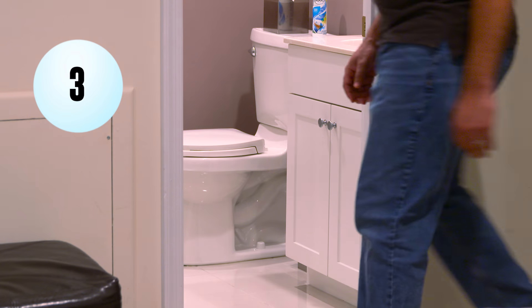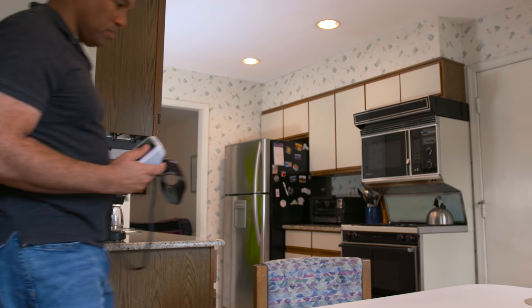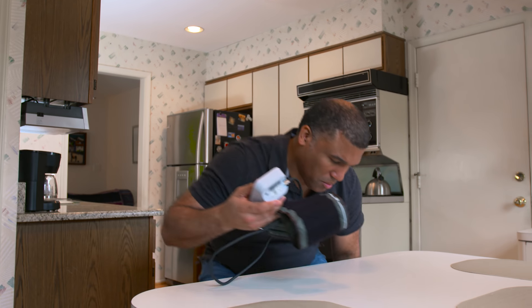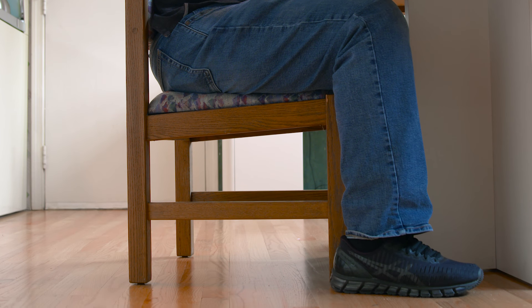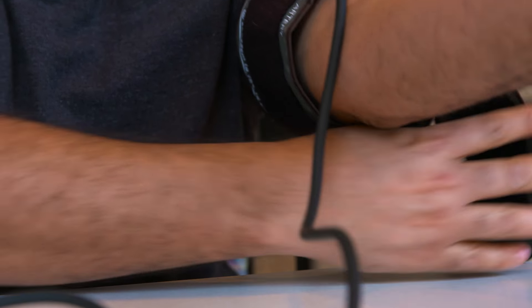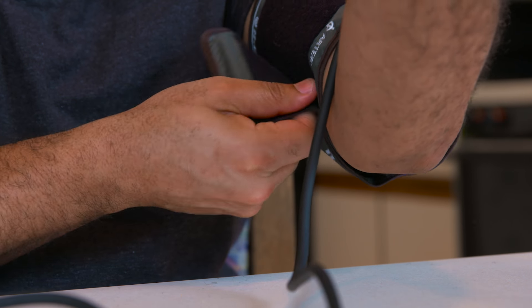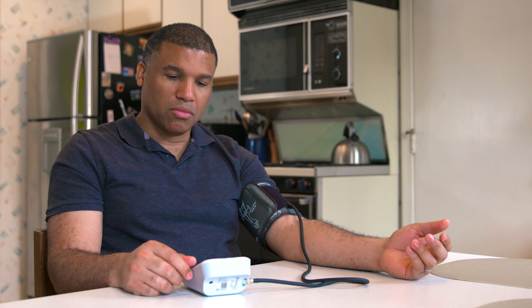Next, make sure to go to the bathroom if needed before you take your blood pressure. Once you're ready, find a quiet place to sit with the blood pressure monitor. Sit in a chair with your legs uncrossed and your feet flat on the floor. Keep your back straight and supported. Place the blood pressure cuff on your bare skin, under your clothing, just above the bend in your elbow. The cuff should be snug around your arm, but not too tight. Support your arm on a table or other surface close to heart level with your palm facing up.